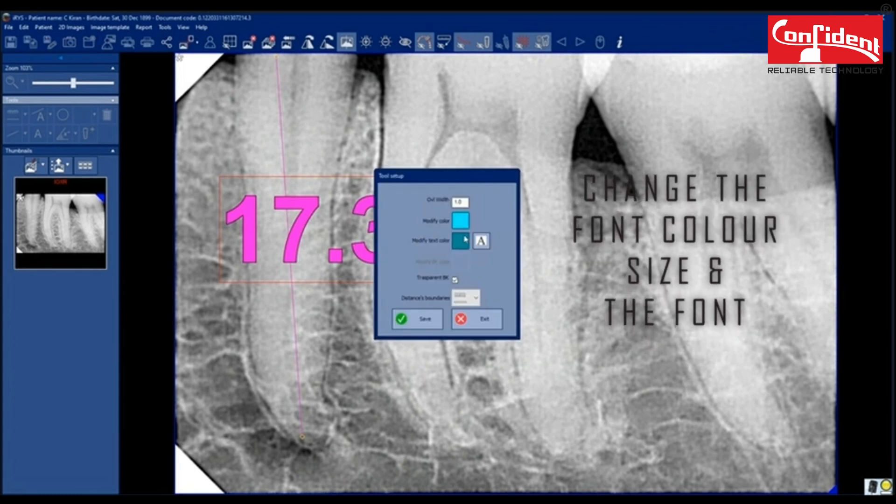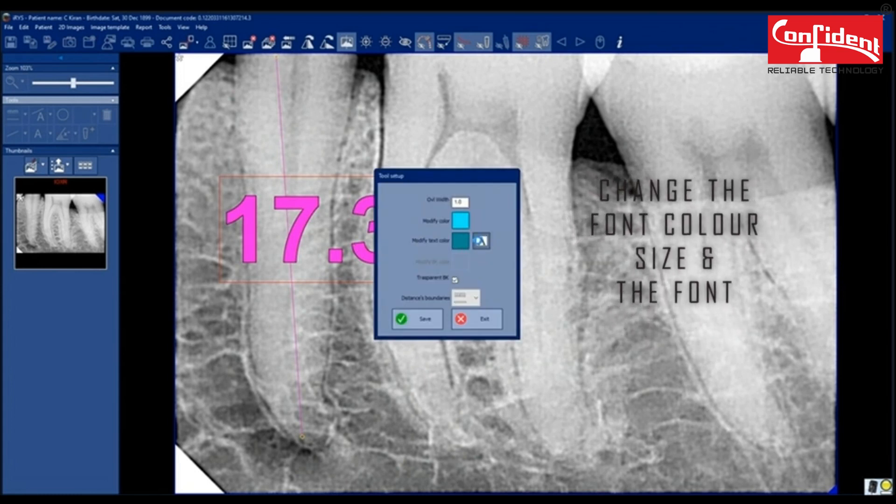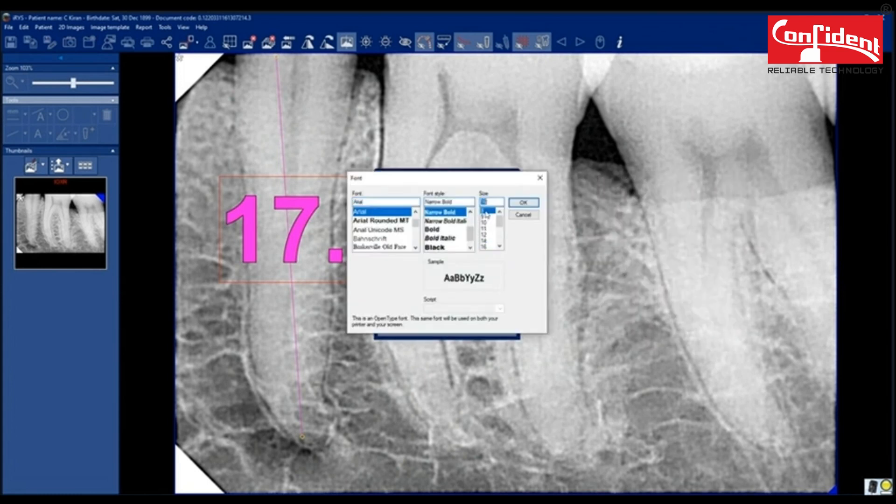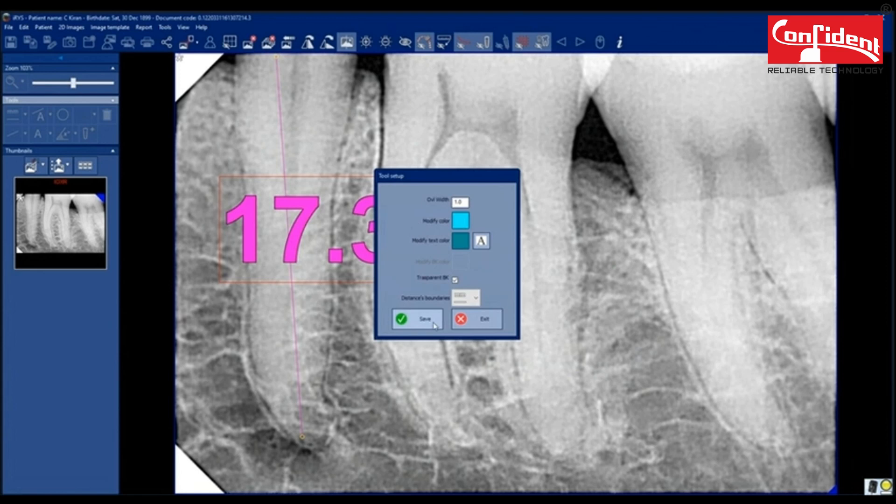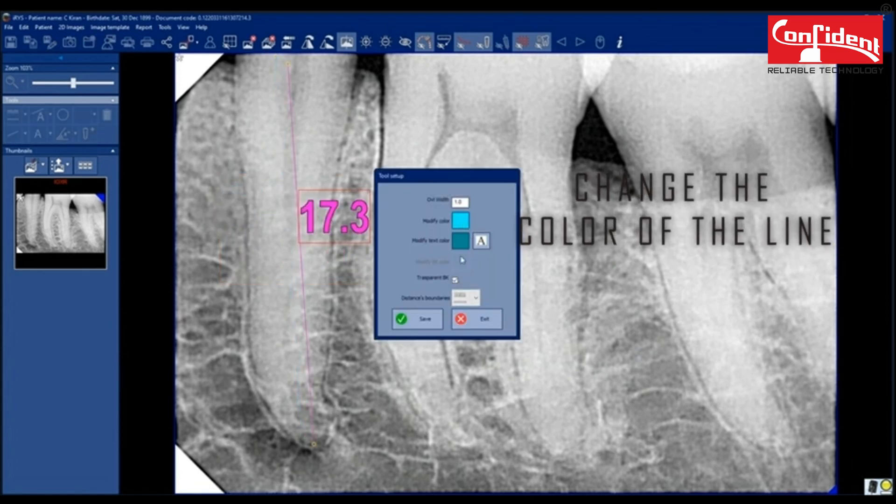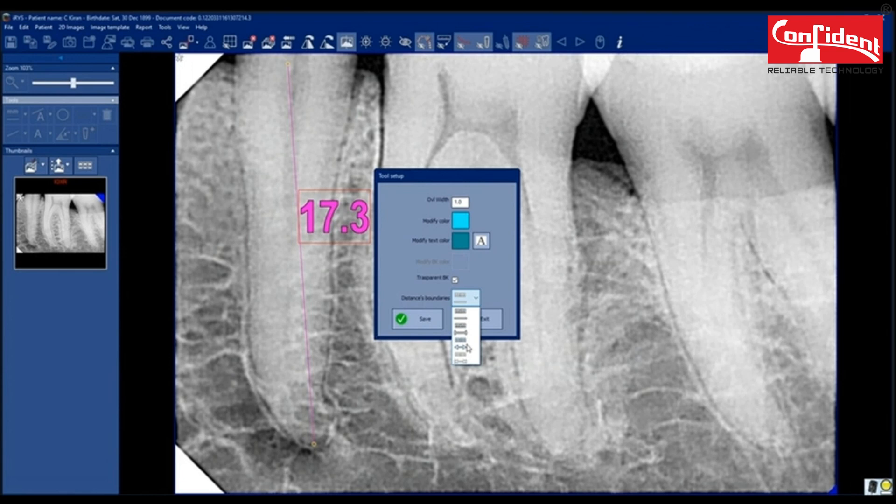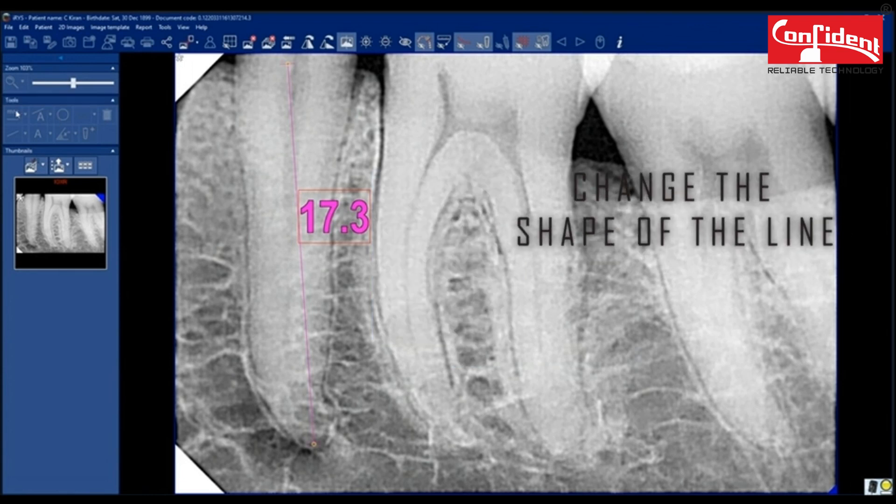Change the font color, size and the font. Change the color of the line. You can change the shape of the line as well.